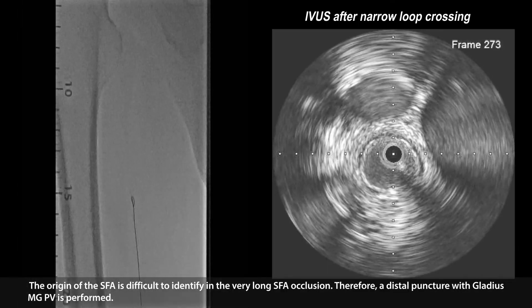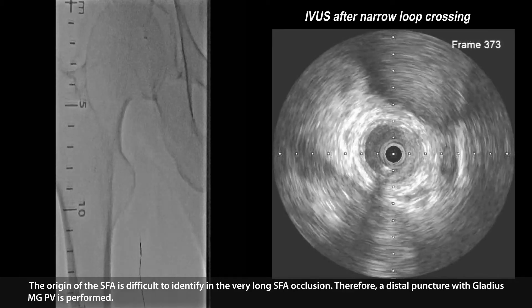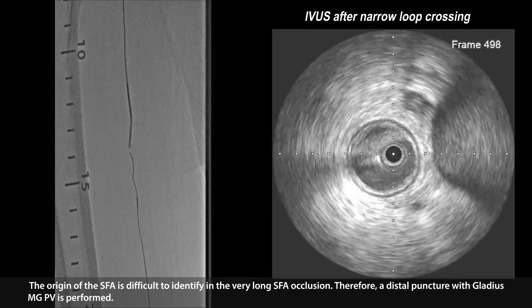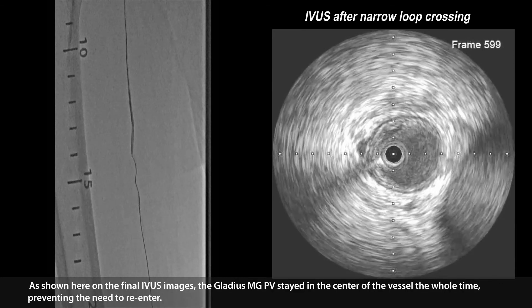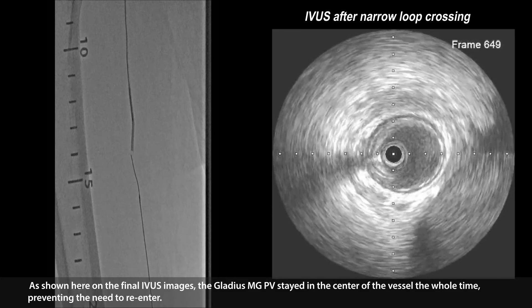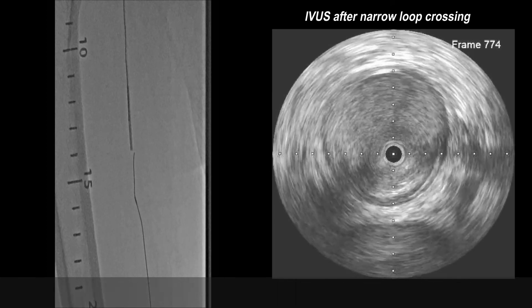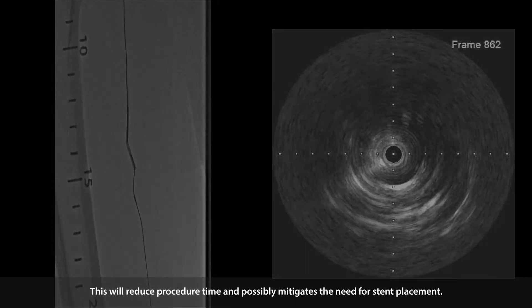The origin of the SFA is difficult to identify in this very long SFA occlusion. Therefore, a distal puncture with the Gladius MGPV is performed. As shown here on the IVUS images, the Gladius MGPV stayed in the center of the vessel the whole time, preventing the need to re-enter. This will reduce procedure time and possibly mitigates the need for stent placements.